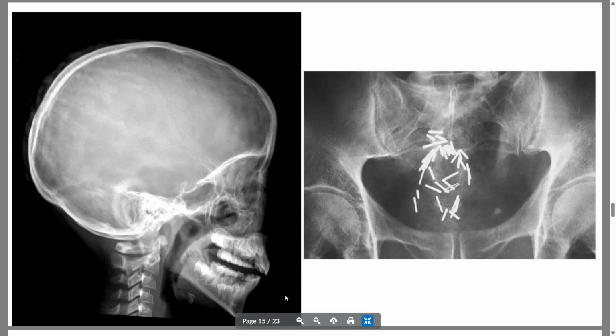All right. This is a much better lateral skull x-ray. We're actually getting all of the face, all of the skull in there, and we'll be doing these next semester as well. You can see these horizontal lines coming across, which could mimic this sign that we look for in certain conditions, where it looks like copper, a type of metal that's malleable. But in this case, this patient actually just has braids. So really dense hair can sometimes show up as radiodense, and you can see braids coming across the patient here.